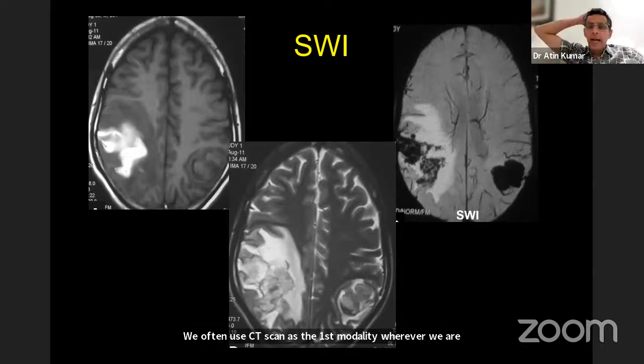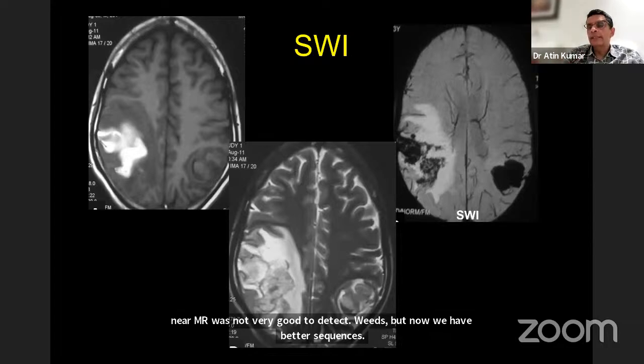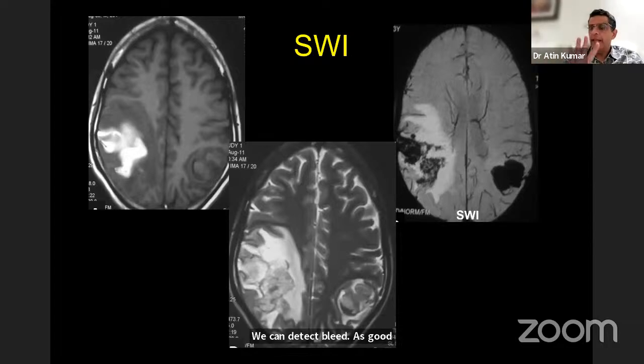Having said that, MR now can also pick up bleed pretty well. Earlier, MR was not very good to detect bleeds, but now we have better sequences. We can detect bleed as good as CT. I will not say better, but as good as CT, especially if it is acute to subacute bleed.